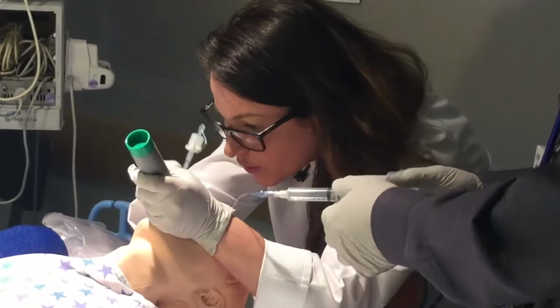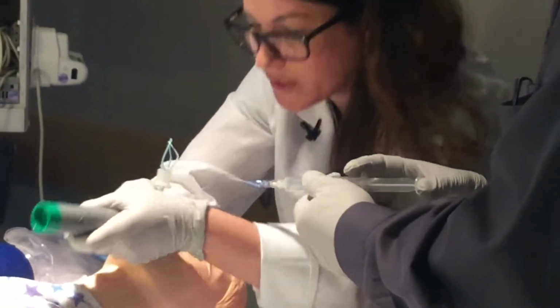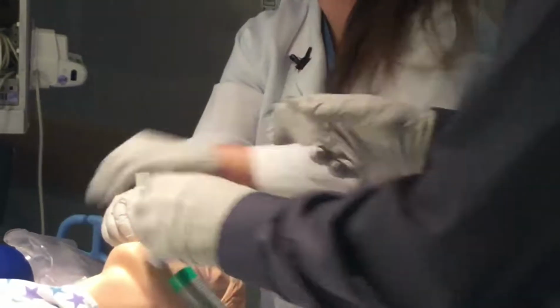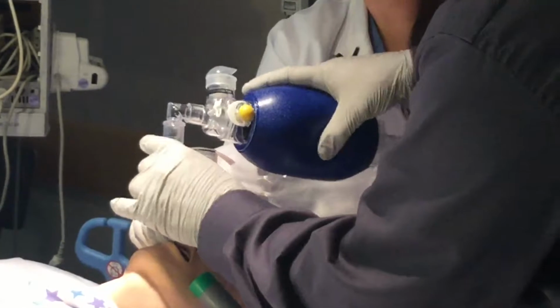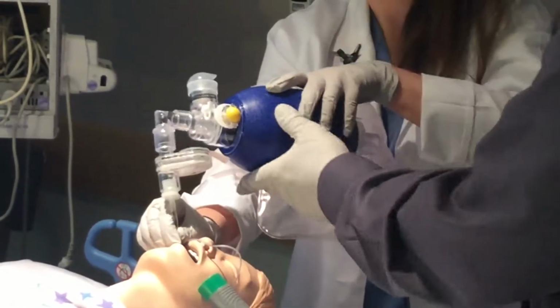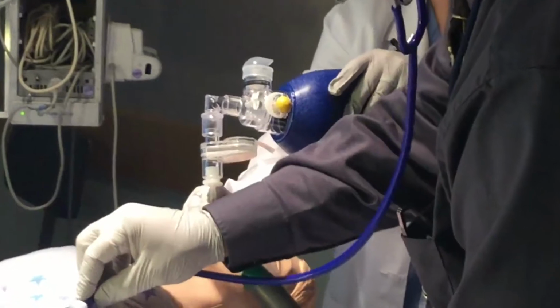I see the vocal cords. We are through the vocal cords. Inflate the cuff. Connect the CO2 detector if available. Confirm color change. Bag, please. Listen for bilateral breath sounds. And listen over the epigastrium.